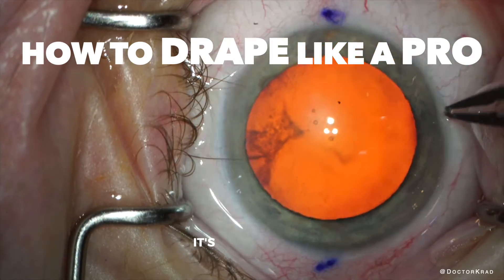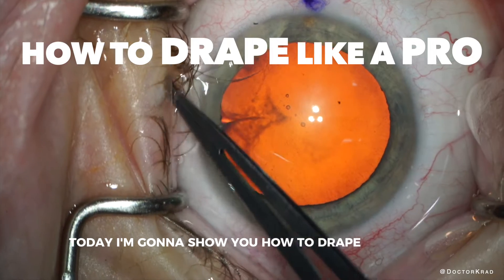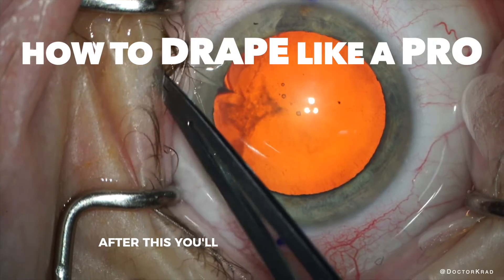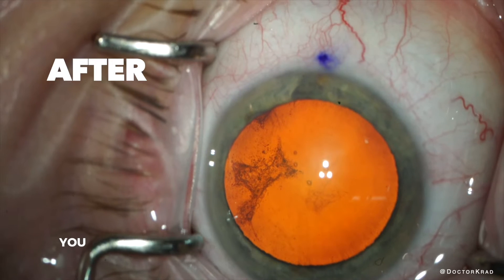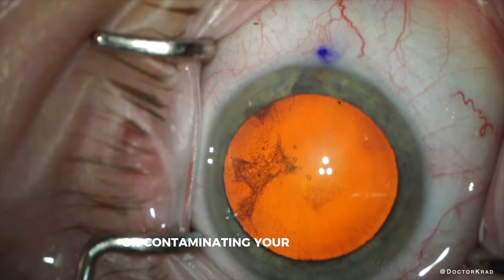Hi everyone, it's Dr. Krax. Today I'm going to show you how to drape like a pro. After this, you will become an expert draper. Hopefully after this video, your draping goes from that to this. You don't want eyelashes photobombing your videos or contaminating your sterile field.